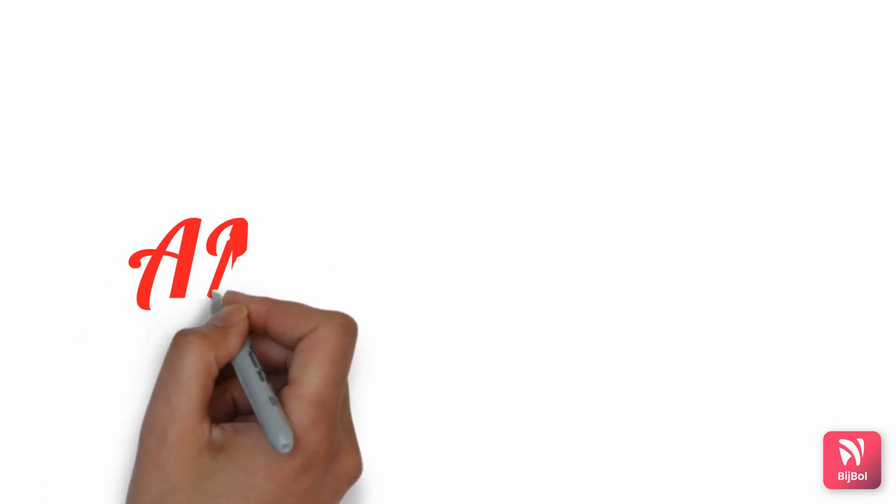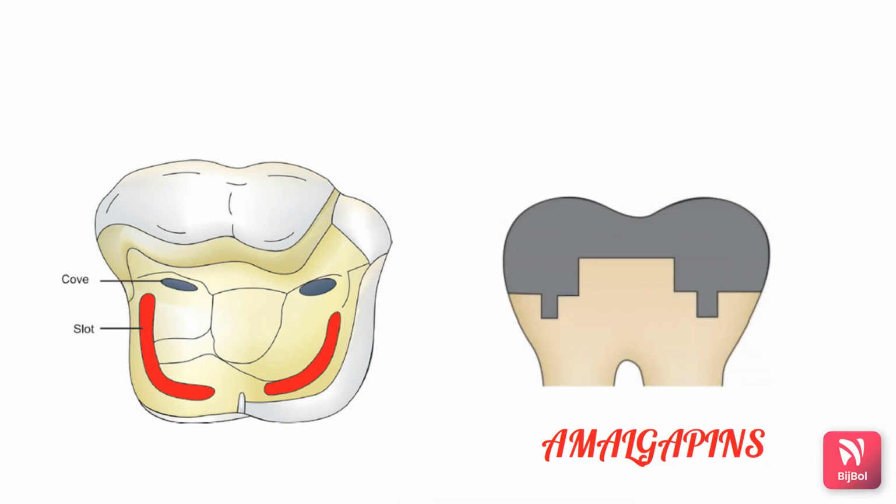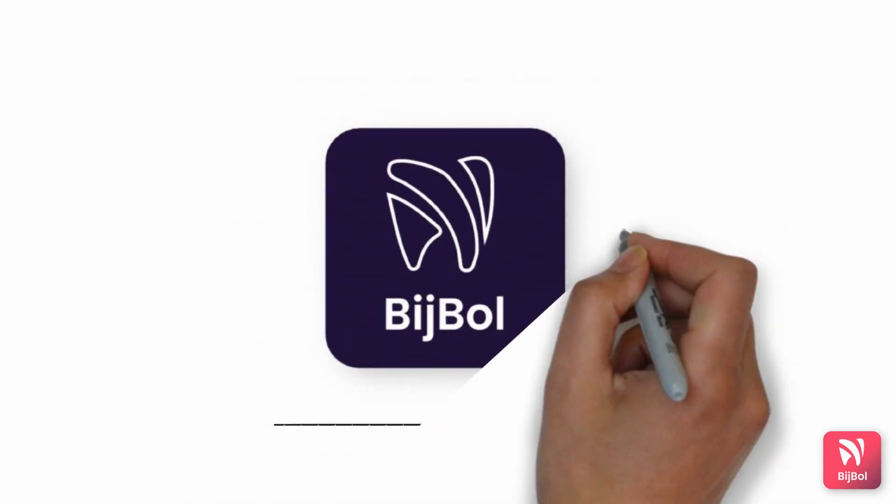Amalgam pins are vertical posts of amalgam anchored in the dentin. The concept of amalgam pins was developed by Shavell in 1980 to allow the amalgam itself to serve as a retentive pin. This channel is prepared using an inverted cone bur on the gingival floor about 0.5 mm within the DEJ, to a depth of 1 to 2 mm and a width of 0.5 to 1 mm. During restoration, the amalgam is directly condensed into the prepared channels using fine pluggers or small condensers.